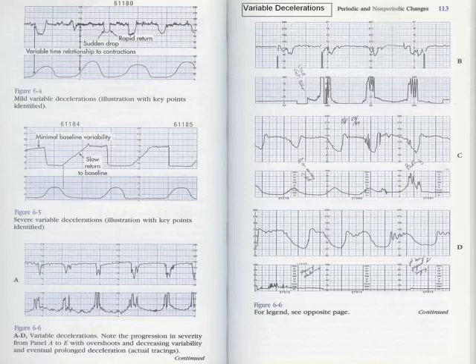More variables. Okay, here's the sudden drop. This is the U-shaped one over here. It's a sudden drop, but it goes up quick. Well, that's different than your late, which is slow to go down and slow to get up. It's a sudden U. This is severe. You see it drop suddenly, but then it just kind of climbs up. That's a severe variable. These are the pushing ones. No big deal.